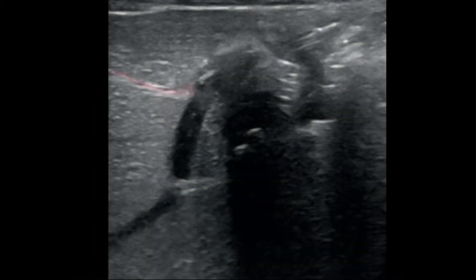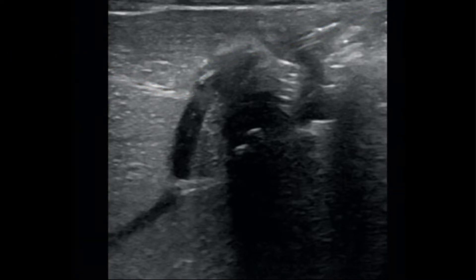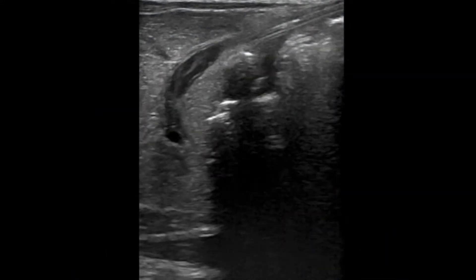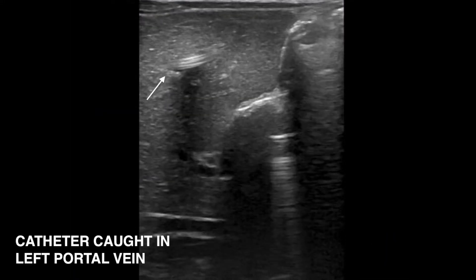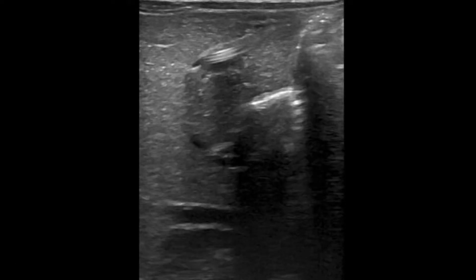In this sagittal ultrasound image, the left portal vein is seen at top left, branching cephalad off the portal sinus and highlighted in pink. The umbilical venous catheter is also seen, highlighted in blue. Here you can see that the UVC has become caught in the left portal vein, rather than advancing posteriorly through the portal sinus.